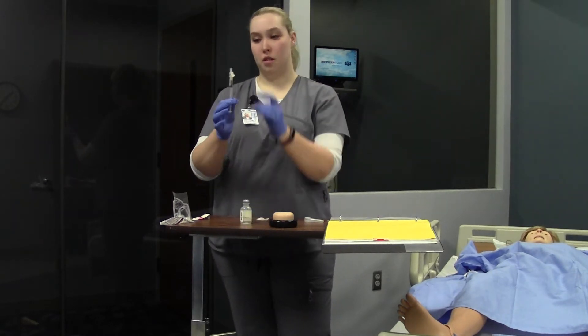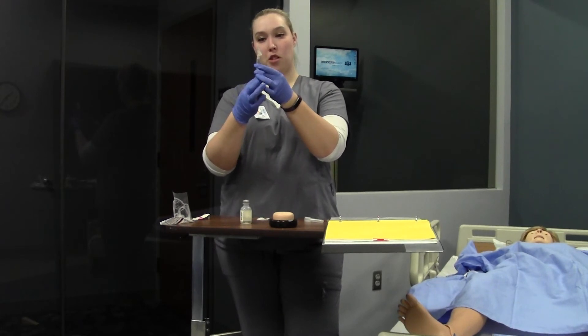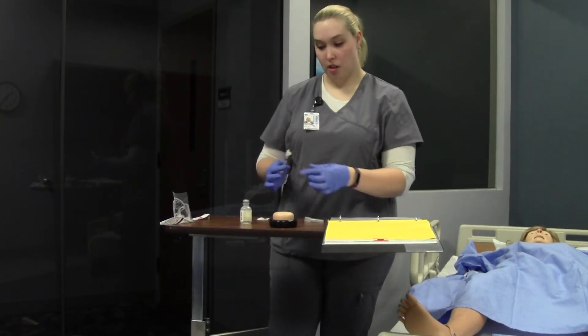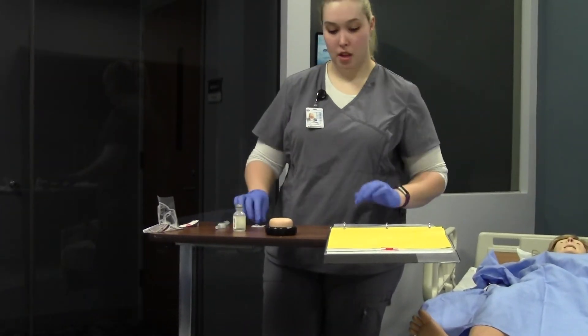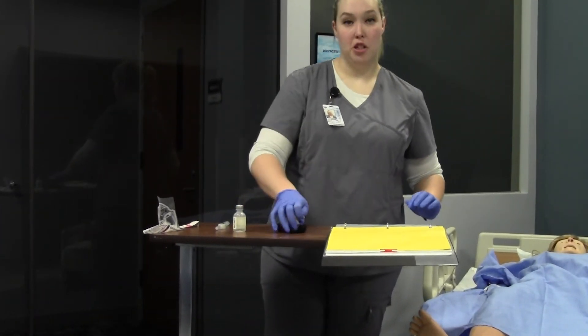All right, I've got my one. I'm going to tap, make sure. I'm going to then scoop my needle for my cover. I'm going to then get my patient ready.